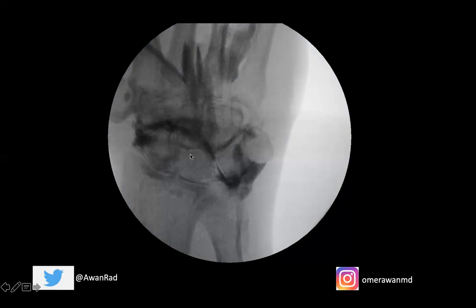This is the lunate. This here is the triquetrum. This circular bone is the pisiform. And then you have the trapezium, the trapezoid, the capitate, and the hamate here. This is the hook of the hamate. These are the five metacarpal bones. And of course we have the radius and the ulna here.